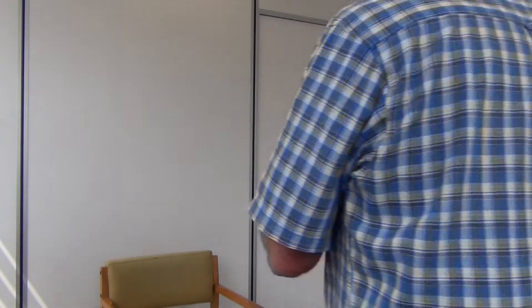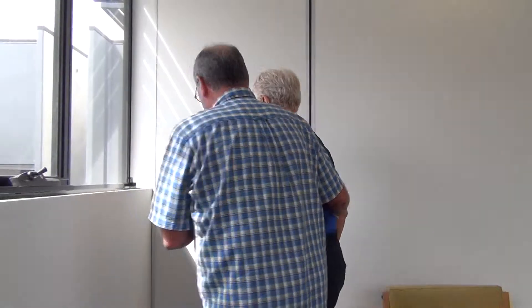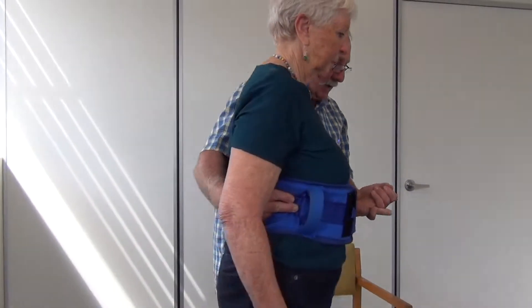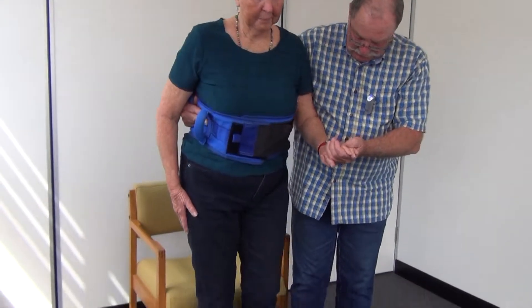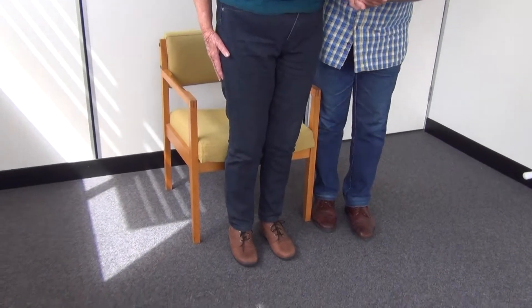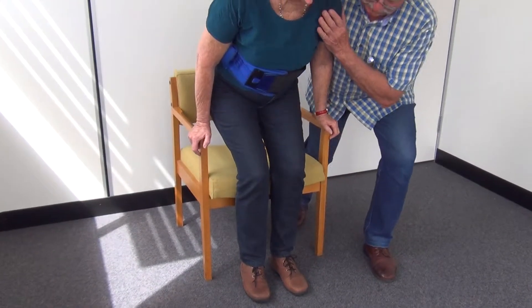We turn around and walk back, going over to that corner and coming back to put our client back in the chair. We walk back until the legs touch and get in a similar position to before — nose over toes, hand on the rail and back we go.